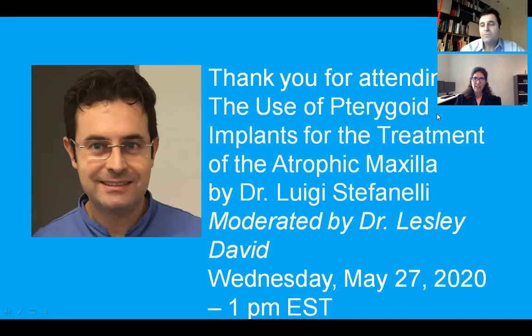Yeah. So I think the reality is it can happen that the density is very low. So what can happen is that you cannot reach the stability of that. Yes, you have to not insert the implant, but if you make all the operation, all the steps in an accurate way, it is quite difficult to malposition the implants.